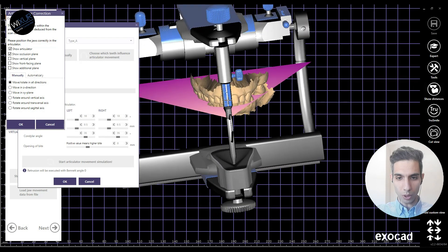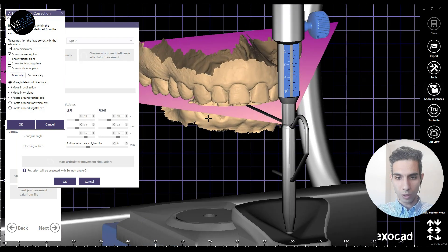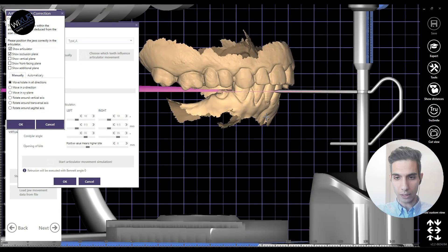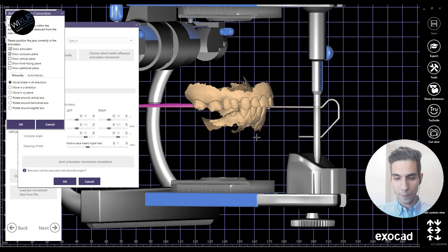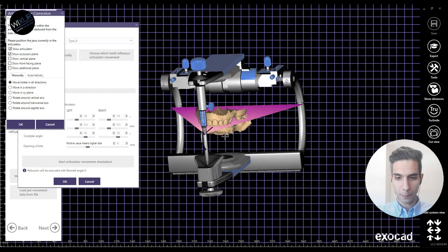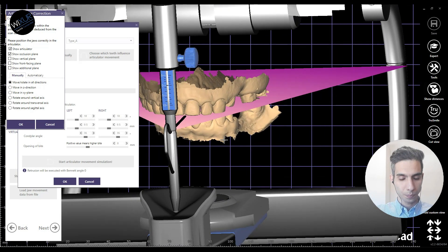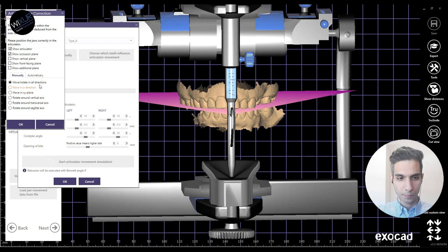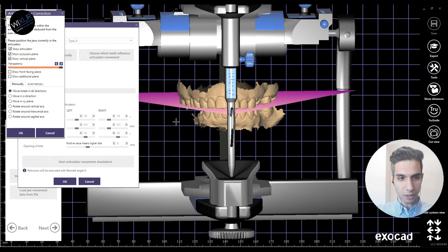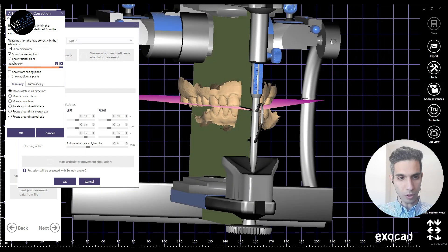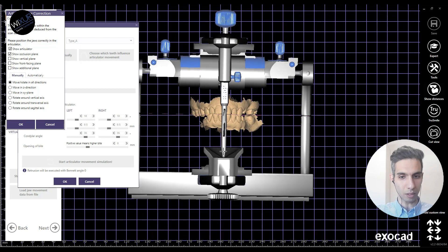What I need to do now is position the upper and lower models in the articulator, paying attention to the midline and the height of the canines. Here on the left side, the vertical plane is also a useful one for the midline of the patient.